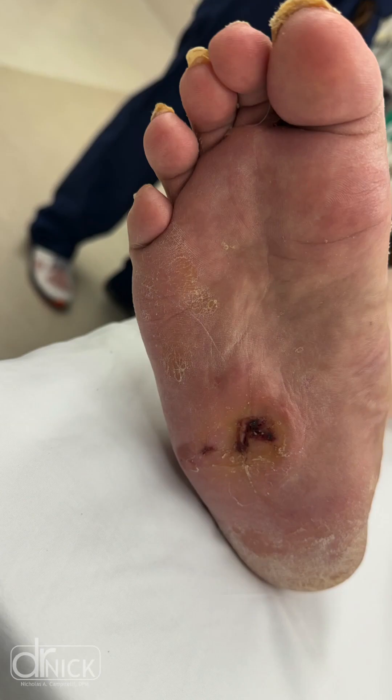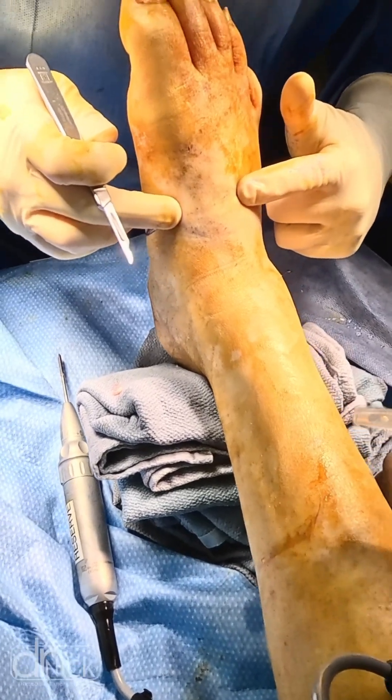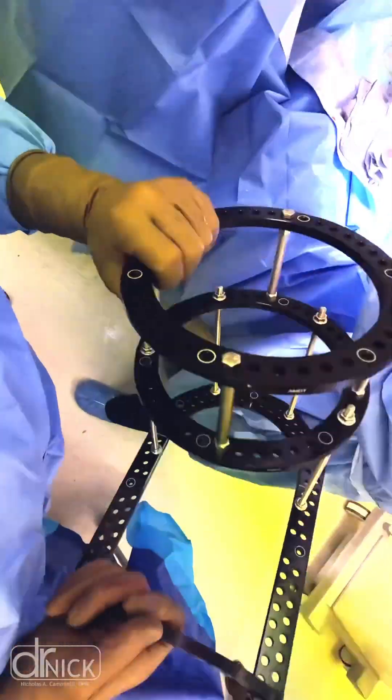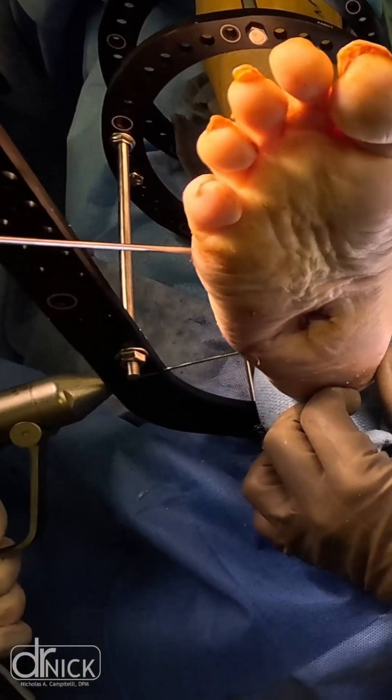We resolved the bone infection with six weeks of IV antibiotics, and then it was time to perform the midfoot reconstruction. We chose to use the Arthrex external fixation device and an Ilizarov frame to reconstruct their midfoot and reduce pressure to take the ulceration away.